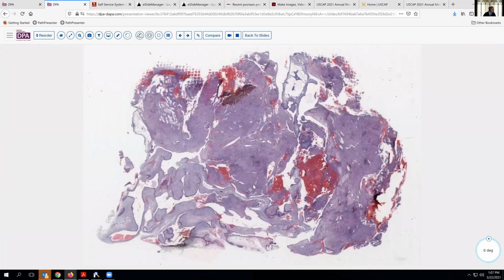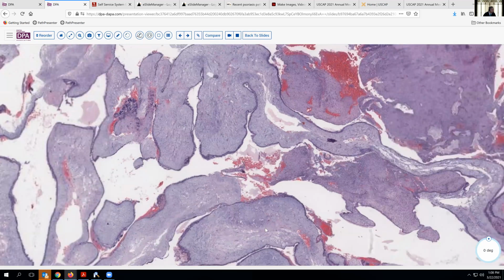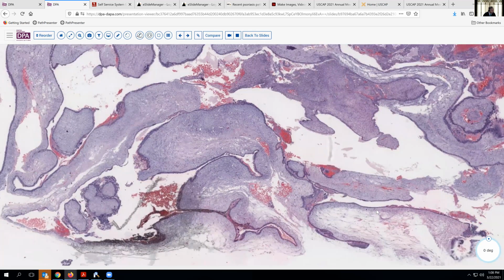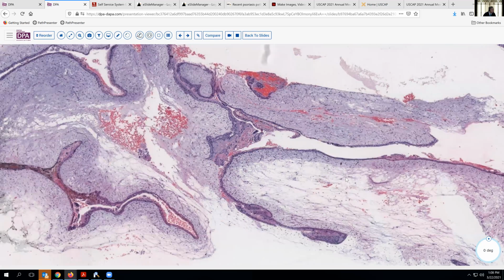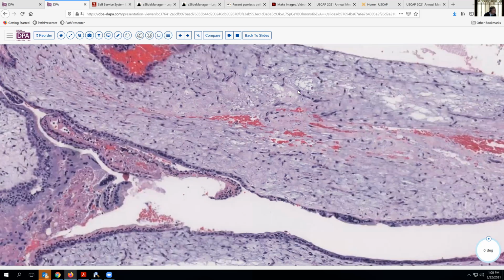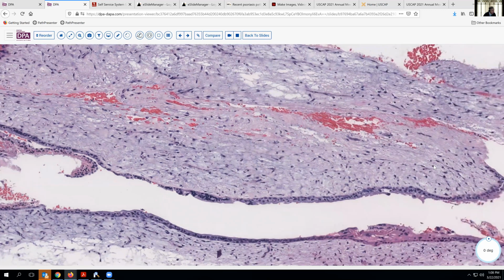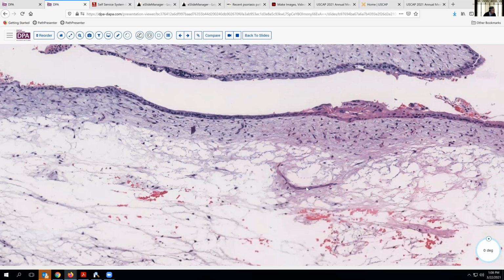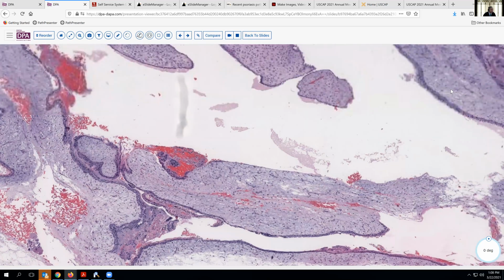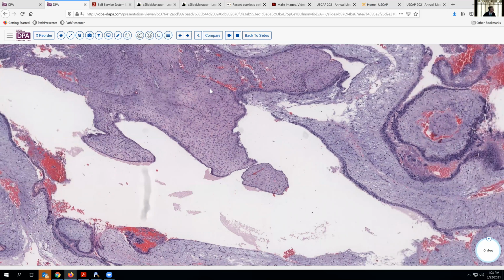Here's another example. Again, we see villi here, not particularly edematous and not much in the way of cisterns, maybe a little bit of an early cistern here or some here. And as we look a little closer at some of these areas, we see areas that might look like they're beginning to form vessels, a few of these little streaky things, but we usually would not identify red cells within the lumina of those pseudovessels. Here's another nice one here. As you see, the lumina is not opened, and there are no intraluminal circulating hematopoietic elements, because there's no fetus and there's no fetal heartbeat to sustain circulation.